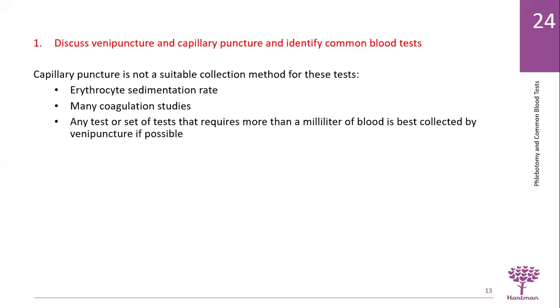Capillary puncture is not a suitable collection method for these types of tests. So we just said that sometimes you'll find cases where the patient has situations and you can't get it from their vein, you've got to get it from their capillary. Well, now we're saying here are some specific tests that you cannot draw the blood through capillary for.